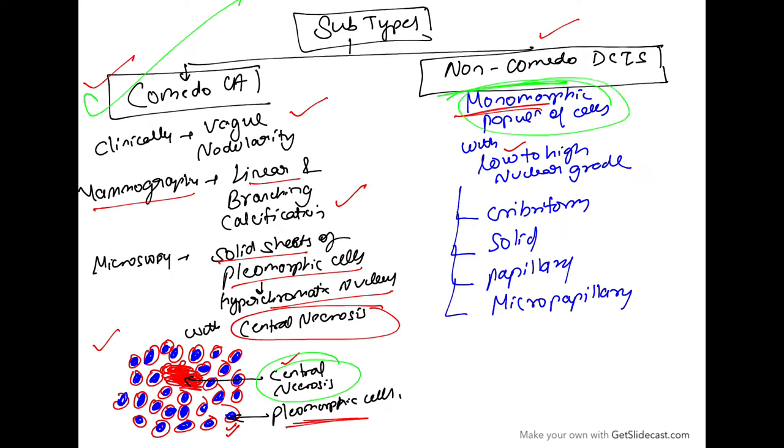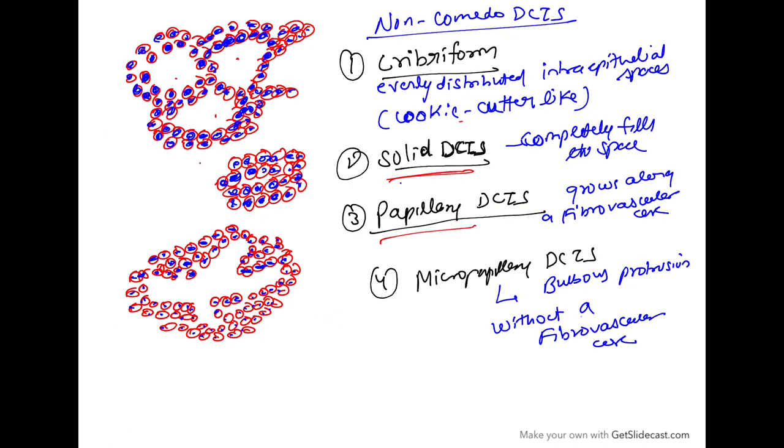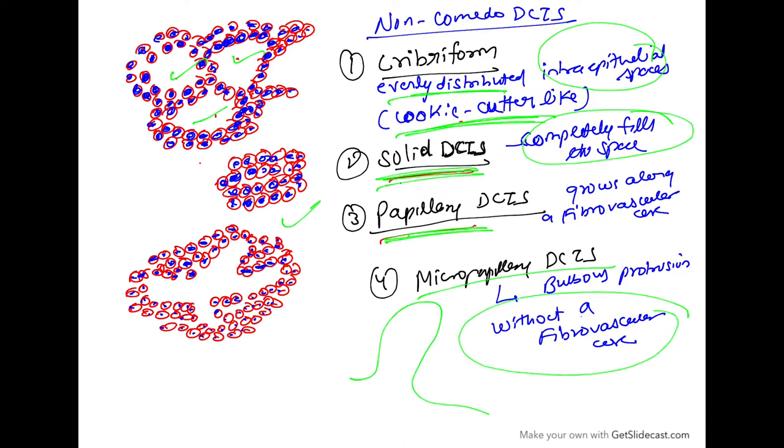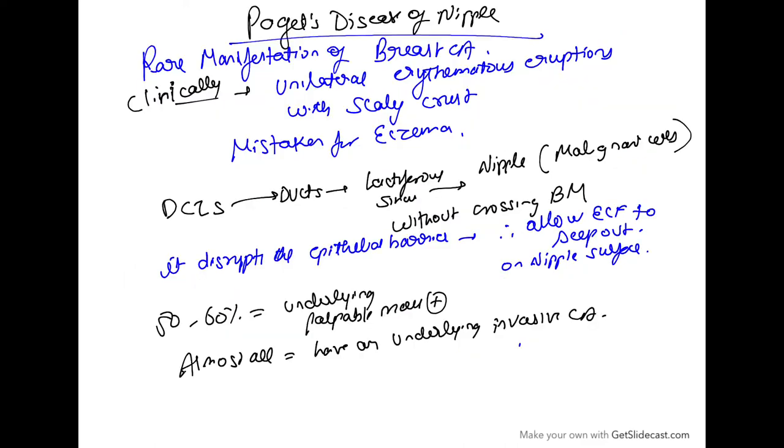Non-comedoid ductal carcinoma in situ has monomorphic populations of cells with nuclear grade from low to high. Subtypes are cribriform, solid, papillary, and micropapillary. Cribriform shows evenly distributed intraepithelial spaces, known as cookie cutter-like appearance. Solid DCIS has solid sheets of cells completely filling all spaces. Papillary DCIS grows along fibrovascular core. Micropapillary DCIS has bulbous protrusions without fibrovascular core.